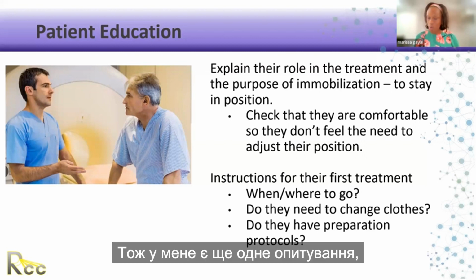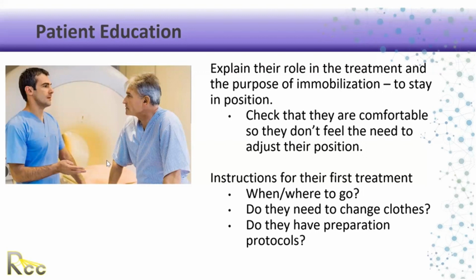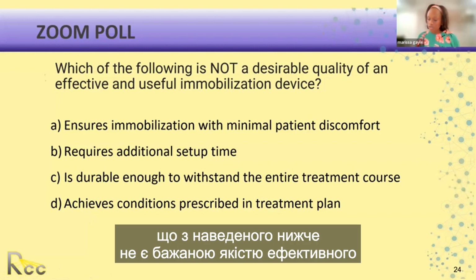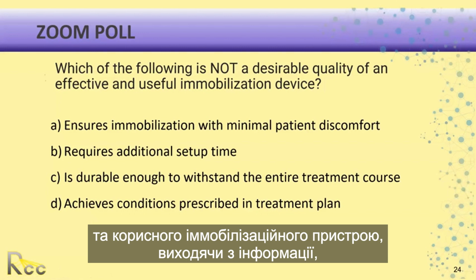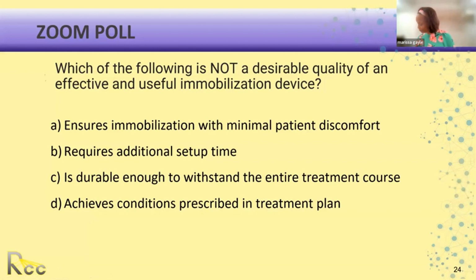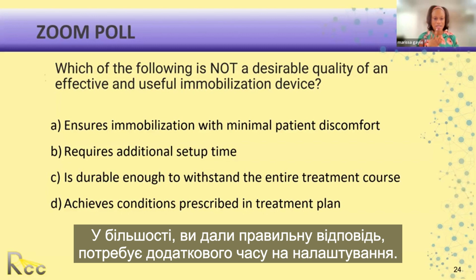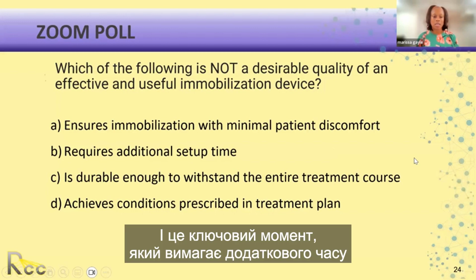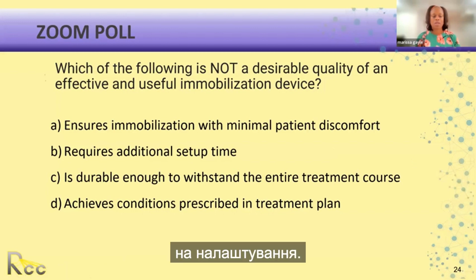So I have another poll. Which of the following is not a desirable quality of an effective and useful immobilization device based on the information I've given you so far? So let's see what you guys get. Majority of you answered the correct answer: requires additional setup time. And that's key, requiring additional setup time.